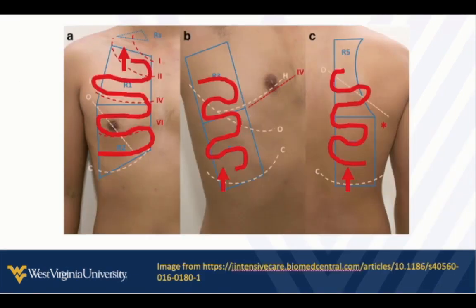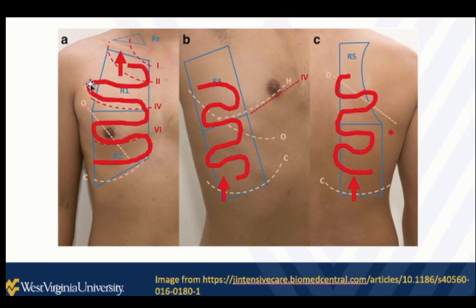So the way I like to do this, like I said, I usually have the cardiac probe in my hand, so I will just start in the front. I'll put it in a pulmonary setting, start with the indicator towards their head, roughly in the mid-clavicular line, second intercostal space or so, and just zigzag, lawnmower my way down their lung, trying to cover as much of their lung as possible to look for findings that are going to help me.